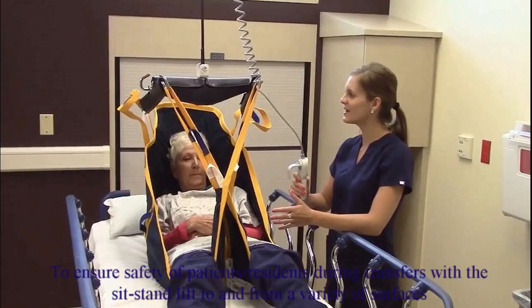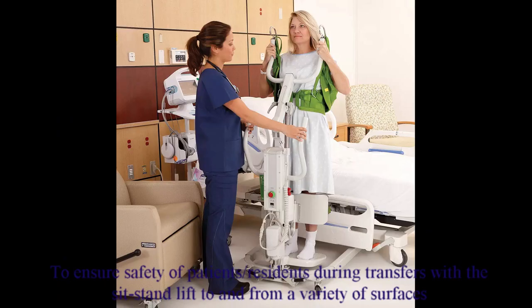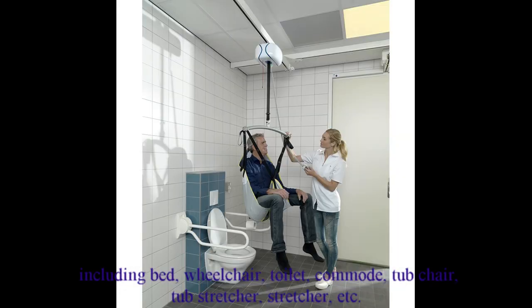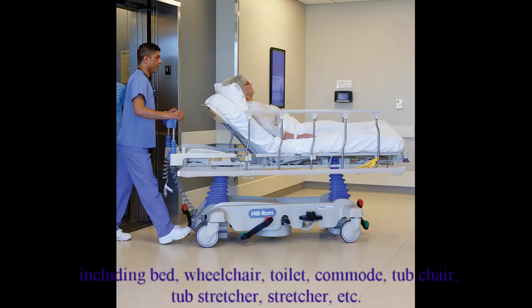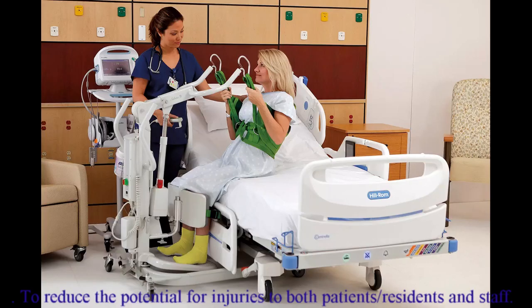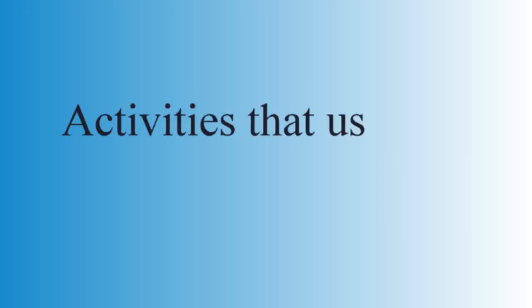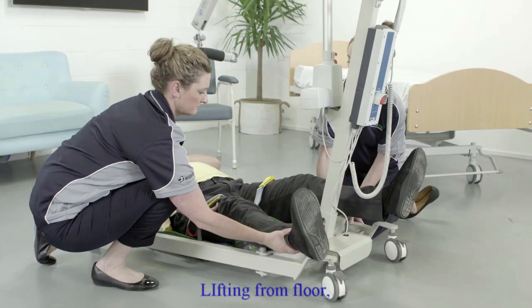1. To ensure safety of patients, residents during transfers with the sit-stand lift to and from a variety of surfaces including bed, wheelchair, toilet, commode, tub chair, tub stretcher, etc. 2. To reduce the potential for injuries to both patients, residents and staff. Activities that use lifts to avoid sustaining a back injury.